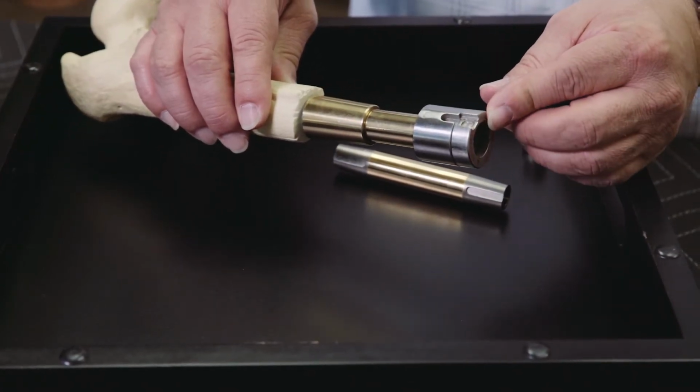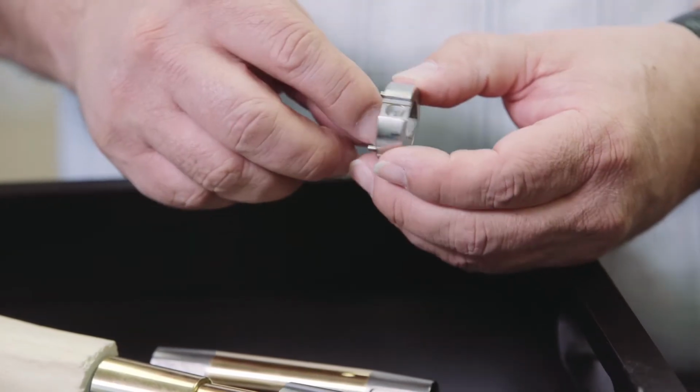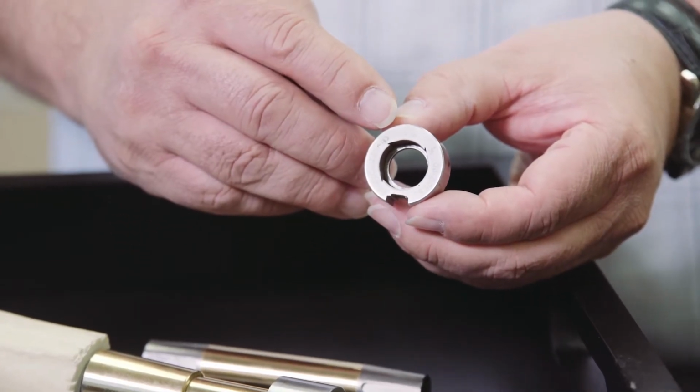It is also important to note that the bushing comes with the pins in different positions depending on the amount of rotation desired for the patient. The degree of rotation is typically printed on the face of the bushing.